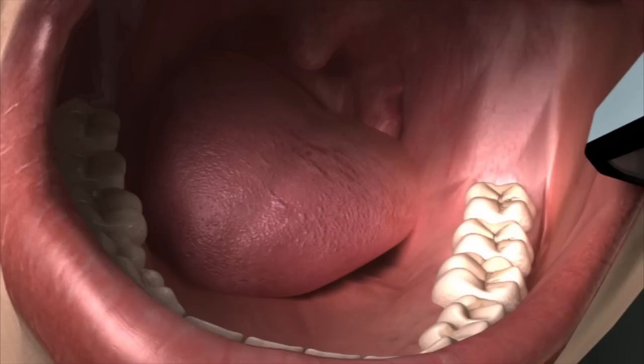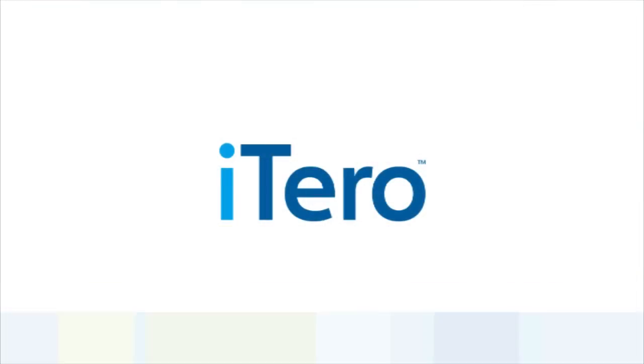You will follow the same buccal rock and lingual palatal twist pattern when scanning the upper arch.